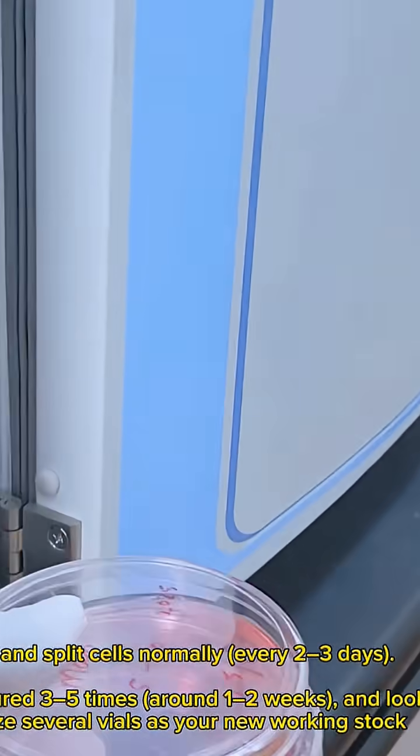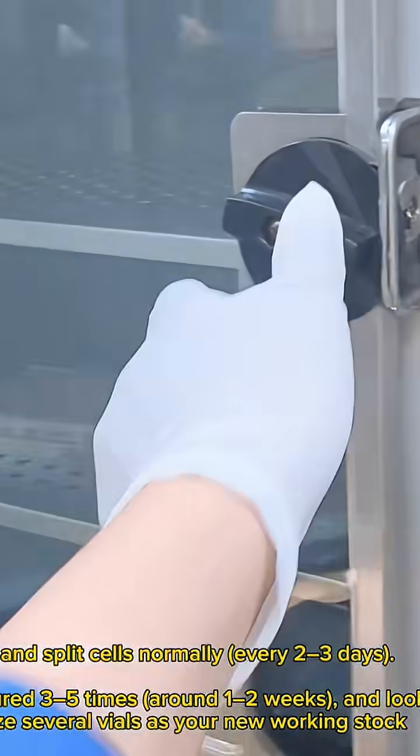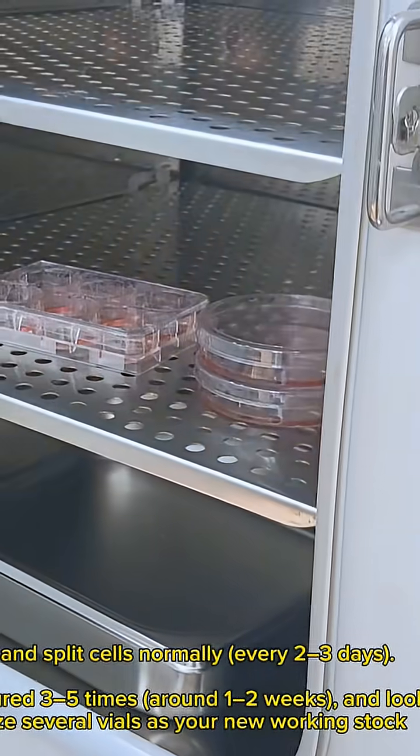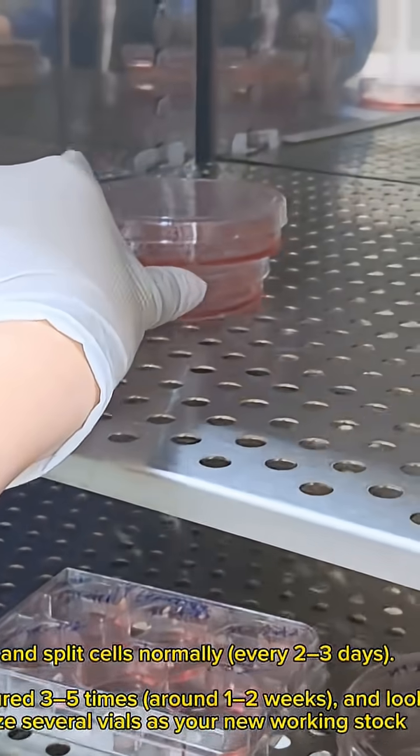Grow and split cells normally every 2-3 days. Once cells have been subcultured 3-5 times, around 1-2 weeks, and look healthy and uniform, freeze several vials as your new working stock.